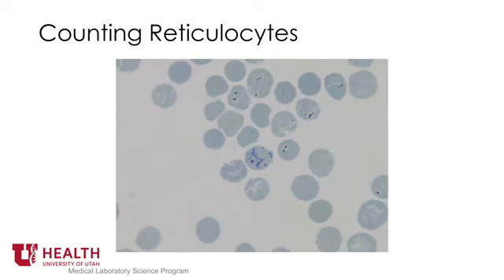The number of reticulated cells is determined by counting 1,000 red blood cells. Red blood cells will appear bluish-green. Count 500 cells on one slide and 500 cells on the second slide. Reticulocyte count is determined by examining consecutive fields of the smear.